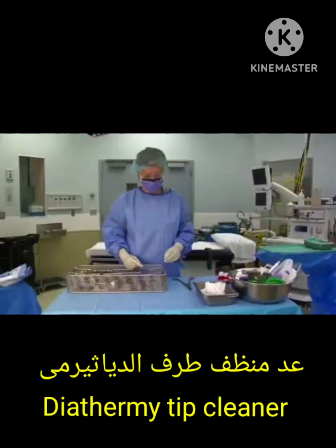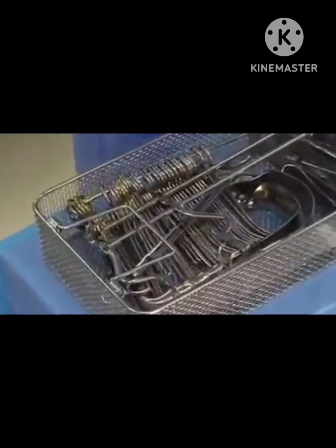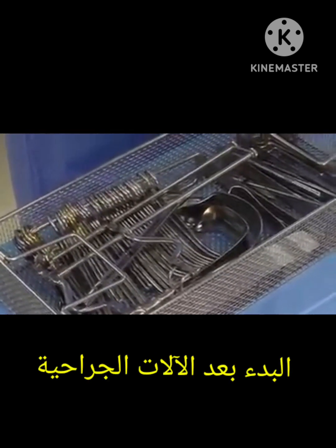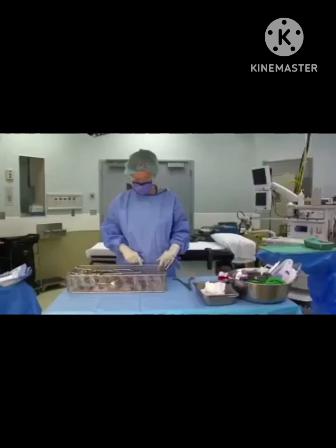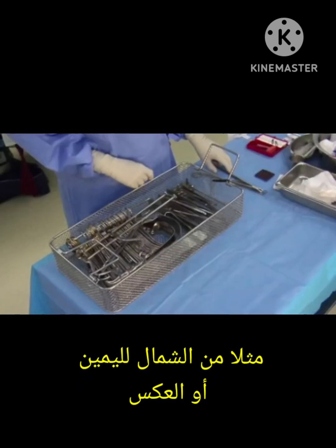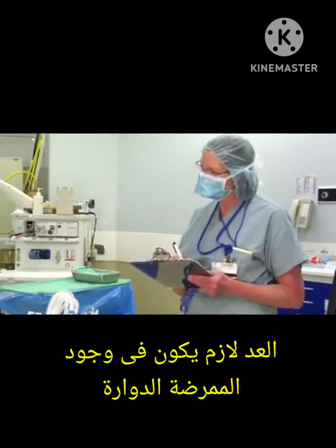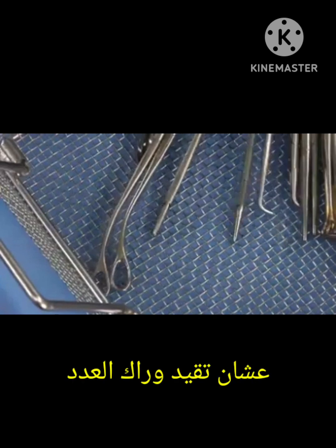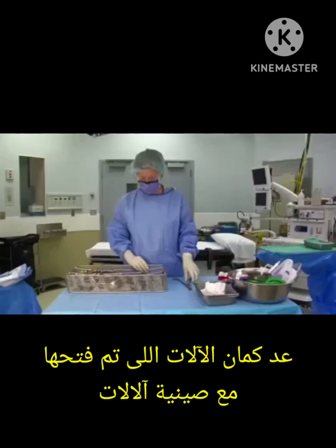Next, count other small miscellaneous items. Display and count the ESU tip, and count the cleaning pad or scratch pad — avoid introduction into the wound as a foreign body. Instrument sets are commonly presented in two forms: on a stringer or holder, and on pins. Instruments are counted in a systematic manner by moving from one side to the other. Do not remove an instrument from the pan until it has been counted.